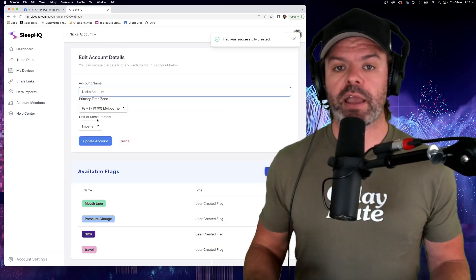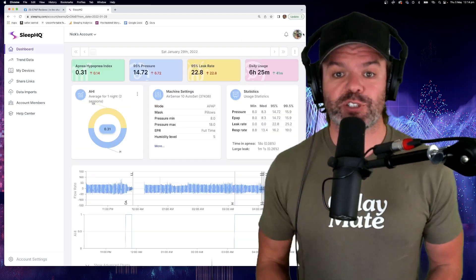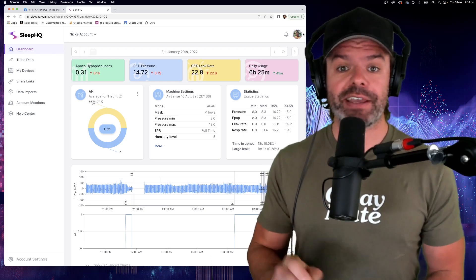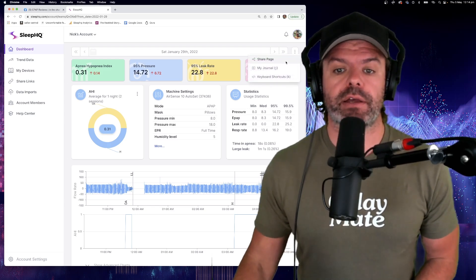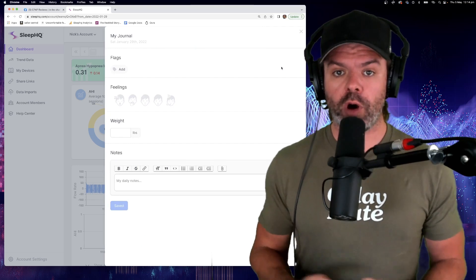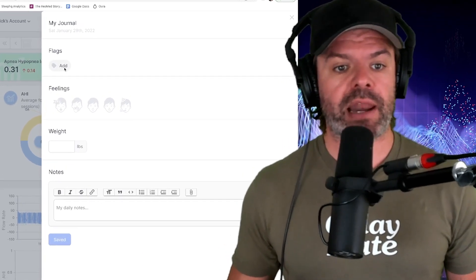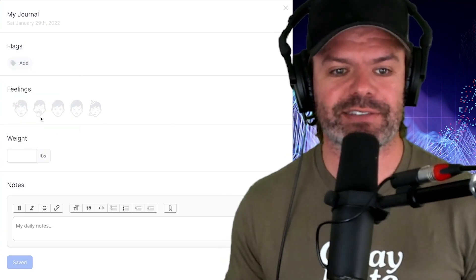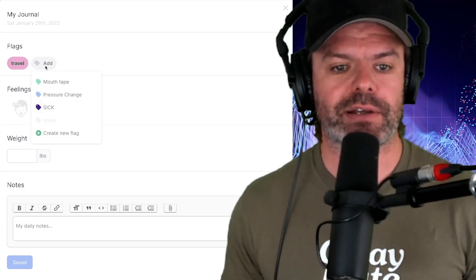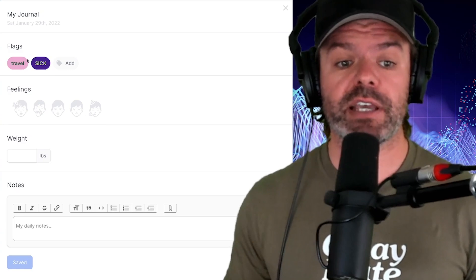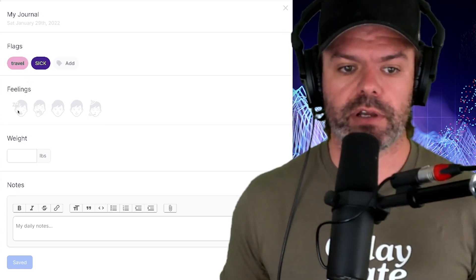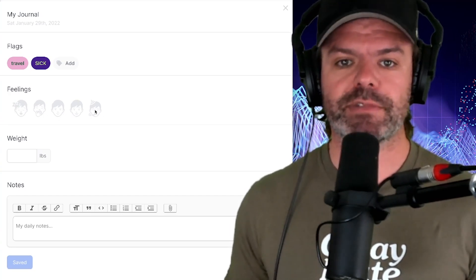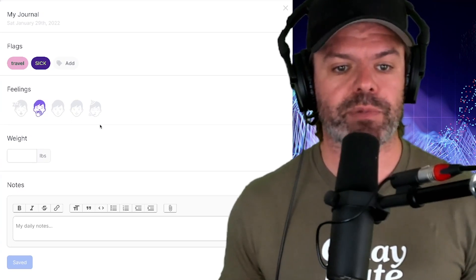Now once I've created a flag, I can now use that and add it to my therapy data and I'll show you that. So to bring up the Sleep Journal, we can simply hit J on our keyboard or we can click the three dots up here on the right-hand side and click my journal. And then the journal will pop in from the side. Now up the top here, we can add our flags. So let's put in the travel flag. All right. And we might put in another one. I was feeling sick. So I've put in two flags here. I can also put how I was feeling on the day. So we've got exhausted, tired, normal, good, energetic. So I was feeling very sleepy on that particular day.